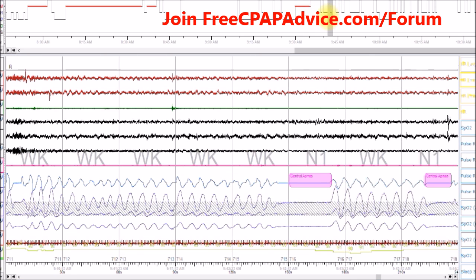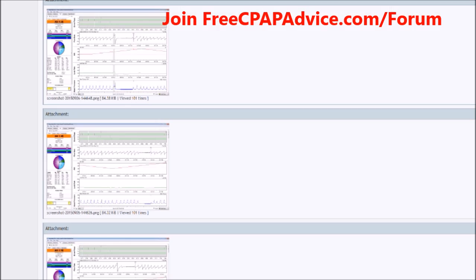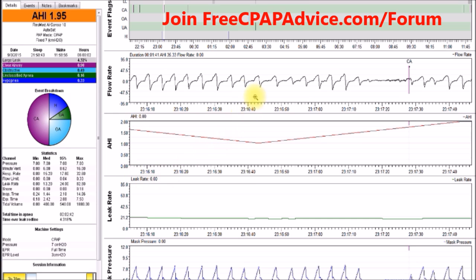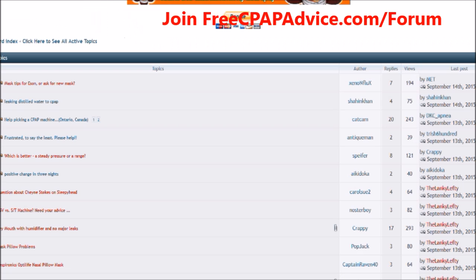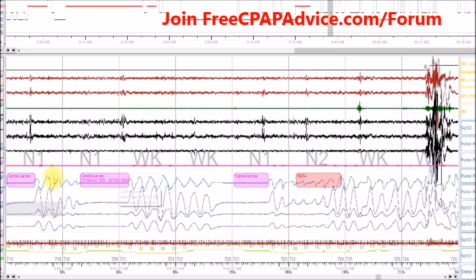Let's compare to one that they did have. This one right here - you can see there is no large spike in front of it. It slowly goes up but then goes down. This one is a true central apnea in my opinion. If you compare this section here with the real examples, you can see it kind of manifests in the same way.